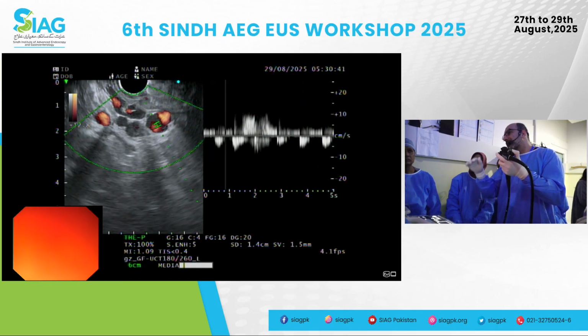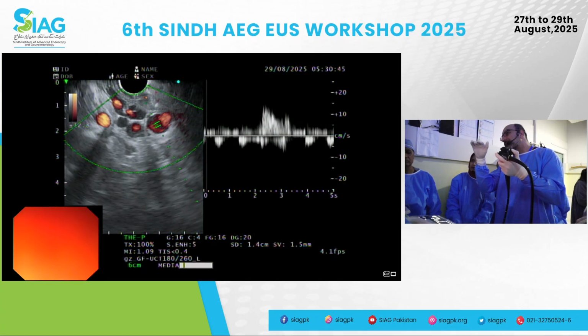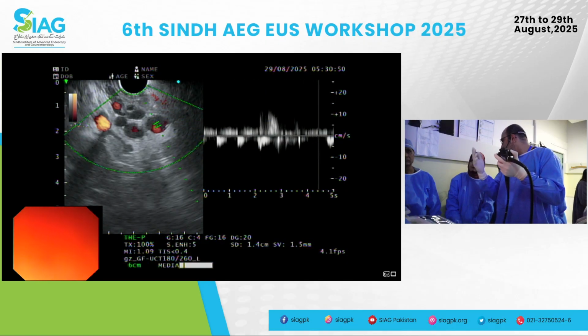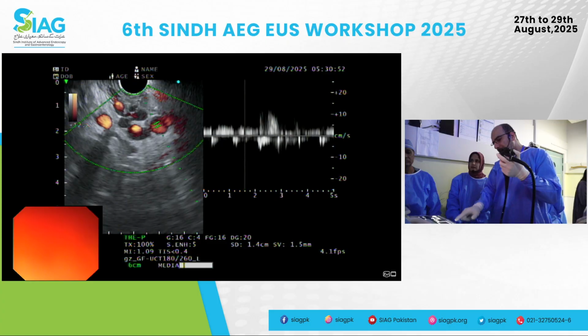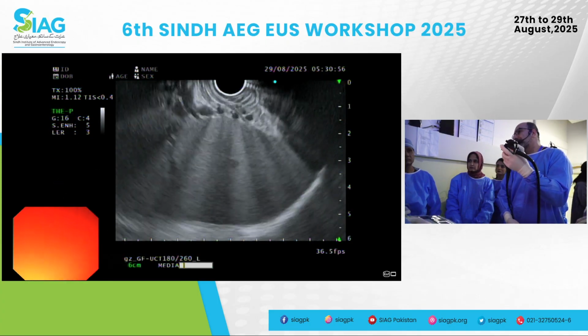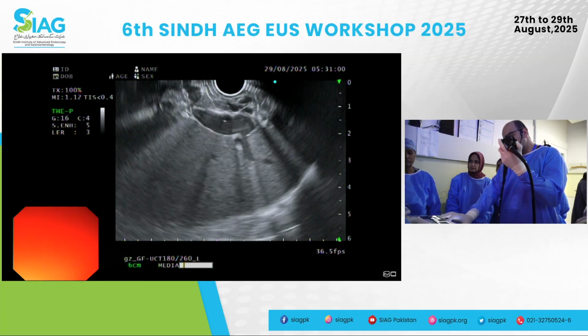And all we see is, it's not a completely flat waveform, but part of that is because of the movement with the breathing. For the most part it's flat, right? So I think you're absolutely right. That's a good pickup on your part, that this is likely splenic vein occlusion with collateral vessels. Okay, and this we can try here. This is one big vessel, so we'll do a Doppler here.